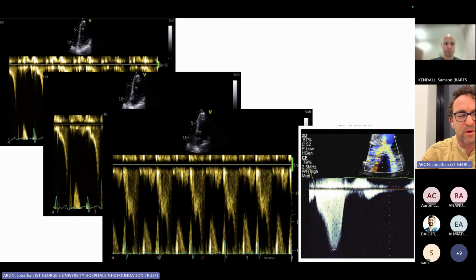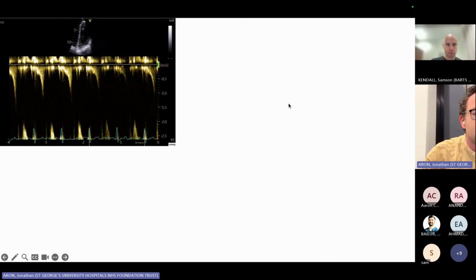I actually cannot remember what I intended to show you there, but these are some waveforms which are typical for left ventricular outflow. Oh yes, I remember. Sorry. If you have very high velocities and turbulent flow and the patient is shocked, you can try and use the pulse wave sample box to work out where in the ventricle the obstruction is. Again, if you're doing this, you have more time on your hands than sense, but this is a technique that's talked about.